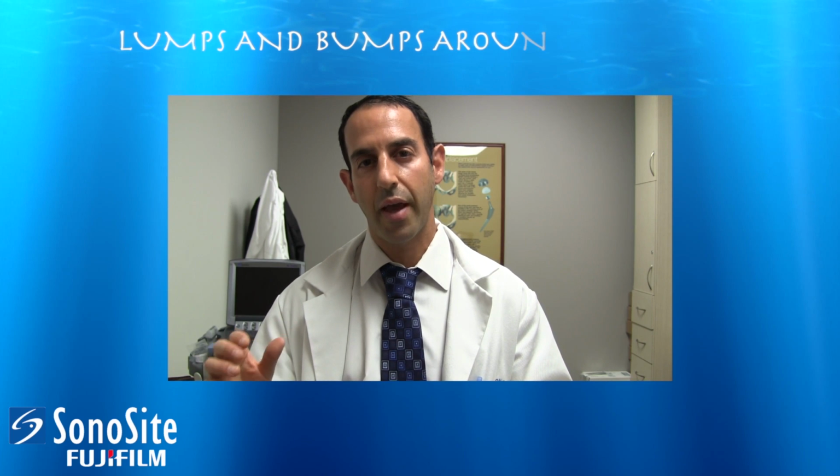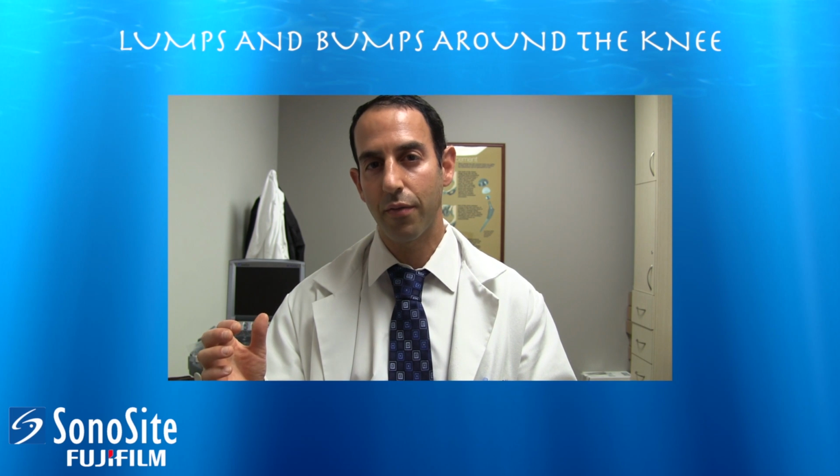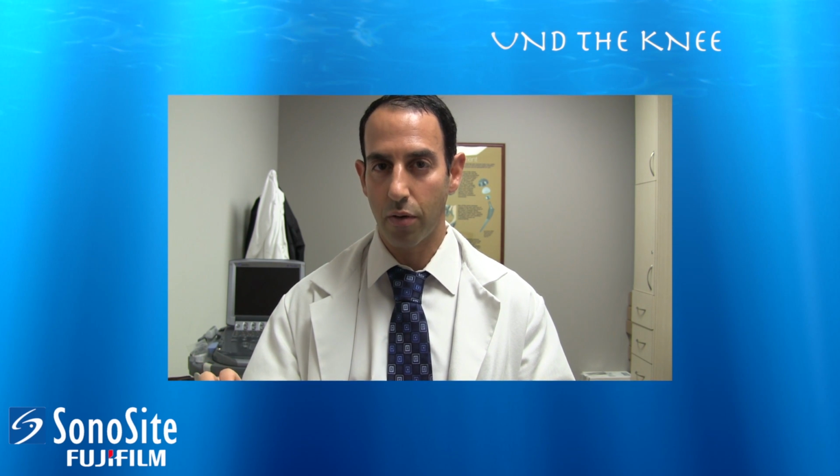Here's a case of a ruptured Baker's cyst, and this case is a great example of how the ultrasound can give you important information right then and there in the office, and I was not nearly as worried about her DVT after doing her ultrasound.